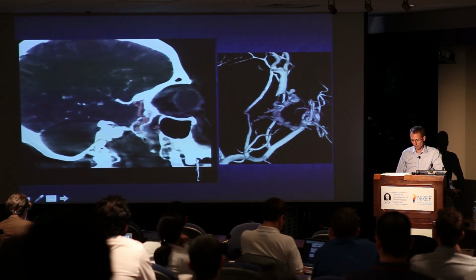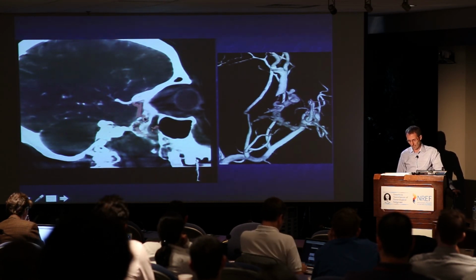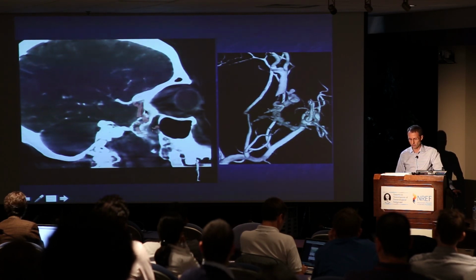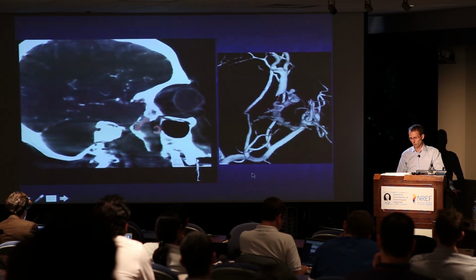As we go back, you can see right here is a little hairpin connection where it becomes intracranial, and these are the cortical veins that are now running retrograde. So if you couldn't approach this from an endovascular standpoint, this has a lot of useful information for the surgeon. We'll talk to Adam and others if they would ever attack this surgically. But the point is, I wasn't totally sure where this fistula was, exactly where the feeders were coming from, and the technology we have in the angiography suite gives us unbelievable detail of what we're dealing with.